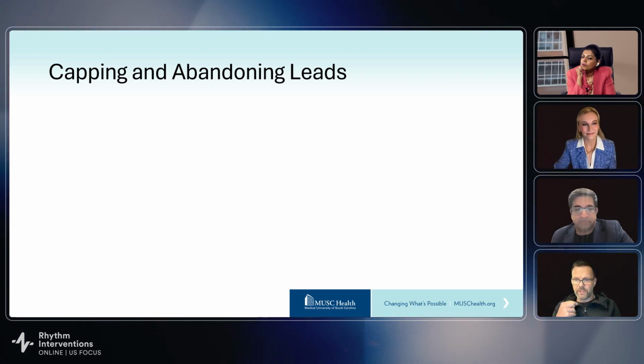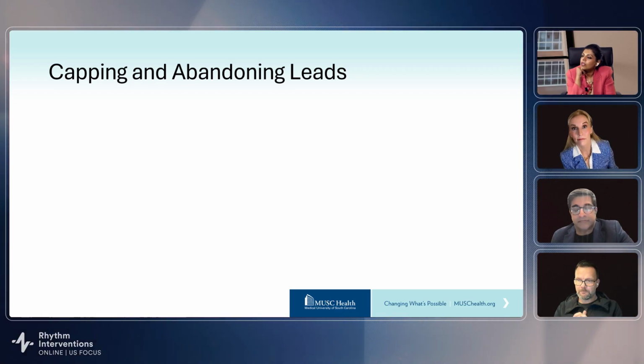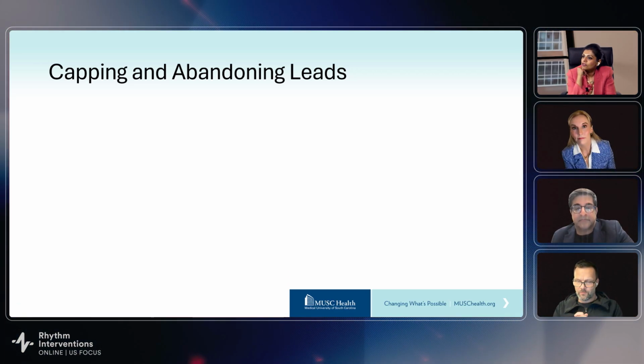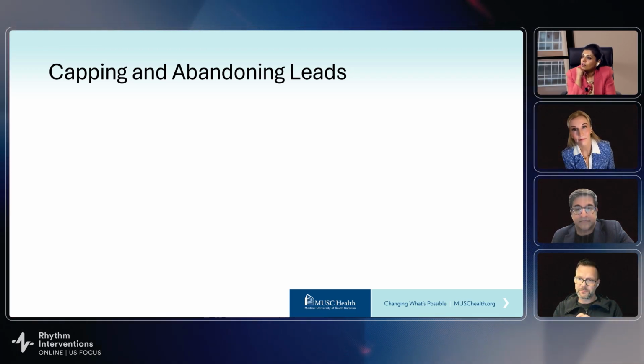I agree. Mostly for if you have any kind of hemodynamic compromise. Sometimes when you pull on the central venous system, you see pressure drops, whether it is because of injury or trauma or just pulling. Do you routinely do venograms to check, or what is your standard of care to figure out what's going on?